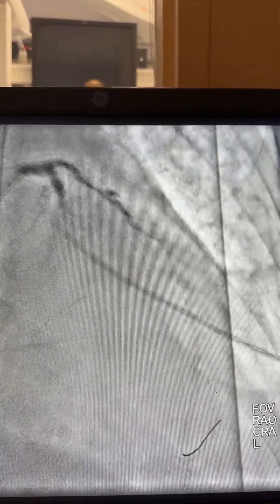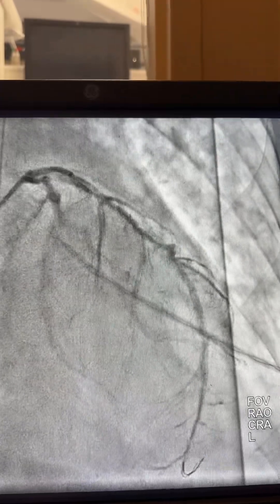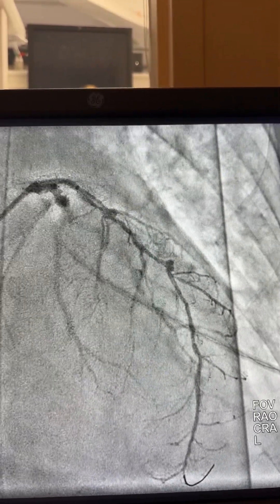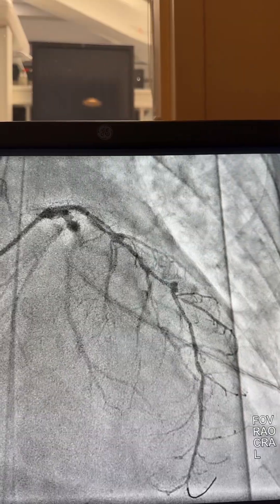We're going to start working with a 2.0 balloon first, then we'll do shockwave. Here is the 2.0 balloon inflated at 16 atmospheres. Here is the injection after the 2.0 balloon — you can see we dissected the plaque, which is very expected. We're going to expect that dissection here.